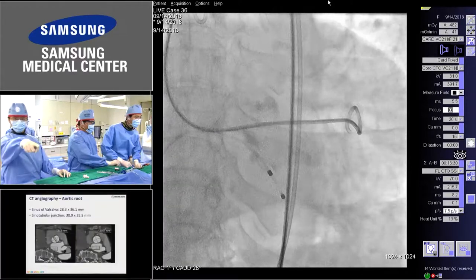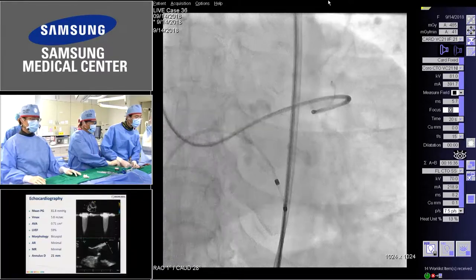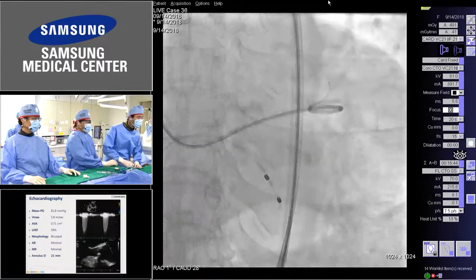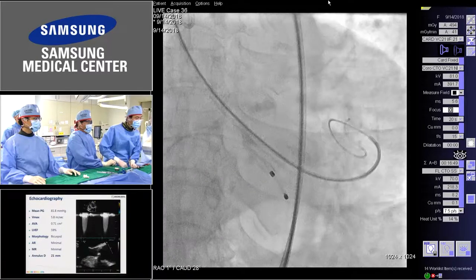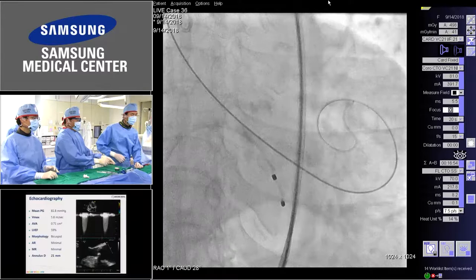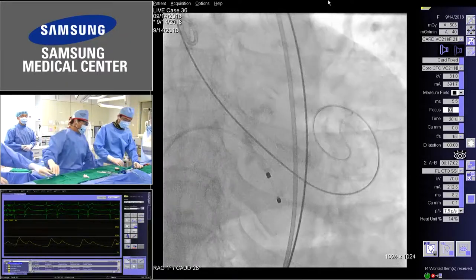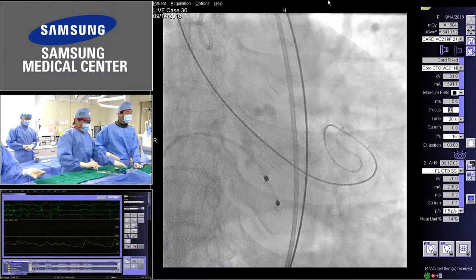Yes, that's what he said. Dr. Gwon, this is Eric. Hi. You know, I'm sitting close to a good friend of ours that a few years ago, when he started to talk about TAVI without predilatation, I swear to God, I wanted to kill him. And we all looked at him like crazy. And since then, all the rest is history, and the vast majority of cases in the world today are being done without predilatation. But if you have another look at the injection to the aortic root.